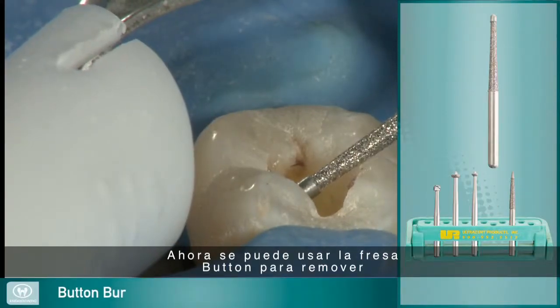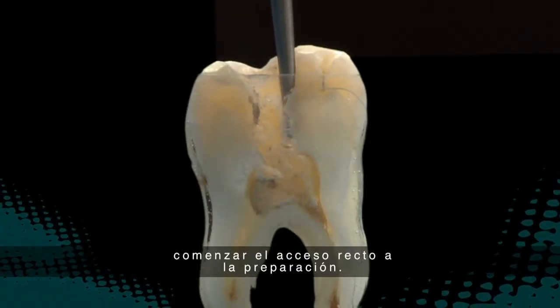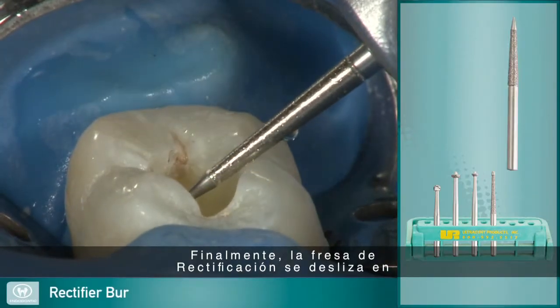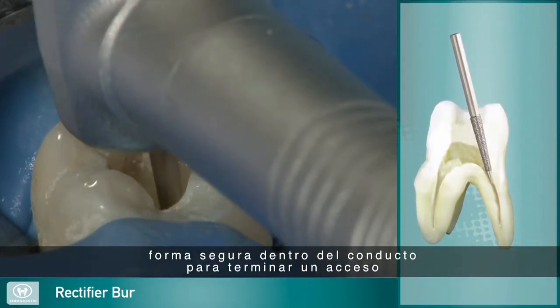Next, the button burr can be used to remove interferences, smooth out the access wall, and begin the straight line access preparation. Finally, the rectifier burr safely slides into the canal orifice to finish a clean, straight line access.